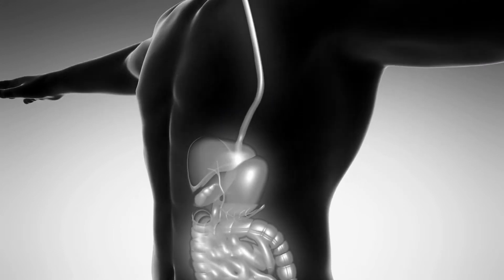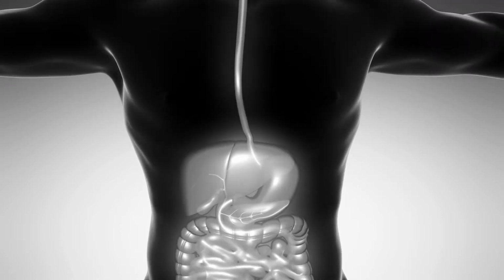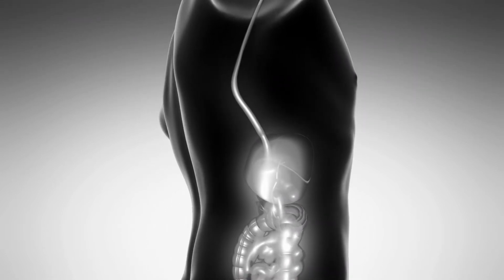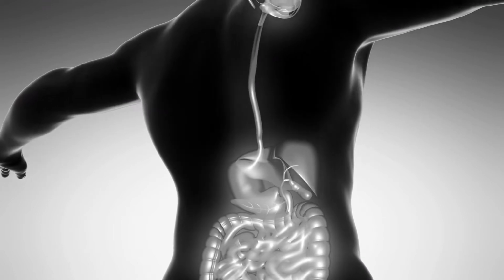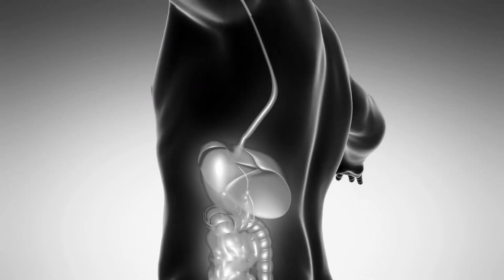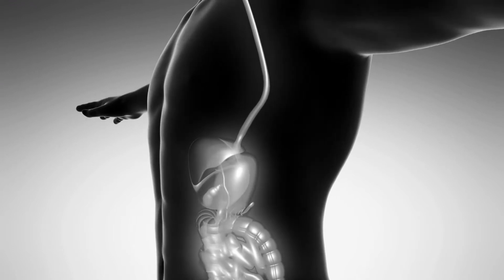After it's triggered, the balloon expands to about 120 milliliters and floats to the top of the stomach, which is more sensitive to fullness. The balloon can then be deflated magnetically to a size small enough to enter the small intestine. The team hopes to conduct another round of human trials within a year.